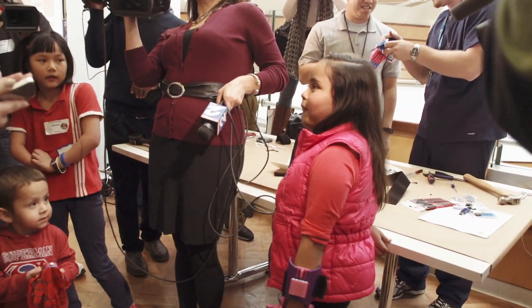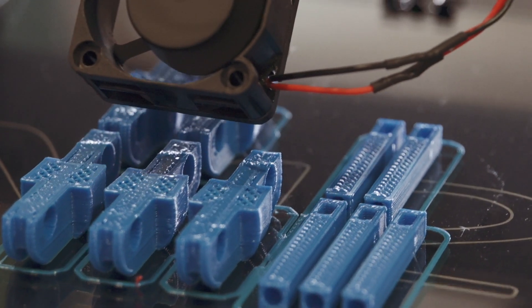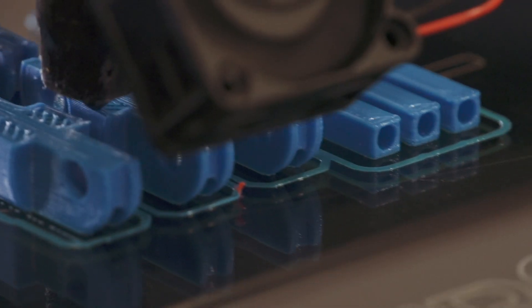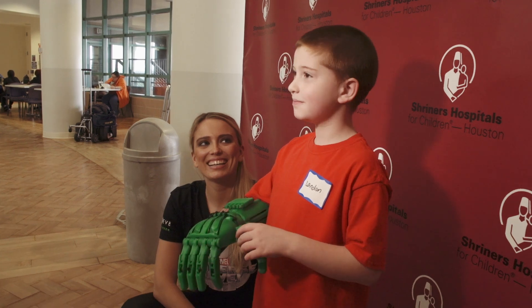This is one of the first things people are learning that they could use their plastic 3D printer for. There are almost 200,000 3D printers out there around the world now. Everybody's buying the technology, but they're kind of wondering what they should be printing. It's kind of like the early days of personal computers. What's been very exciting is people realize that by using the 3D printer you could make these very robust mechanical hands that could help people in need.